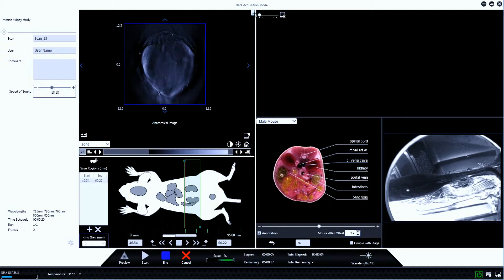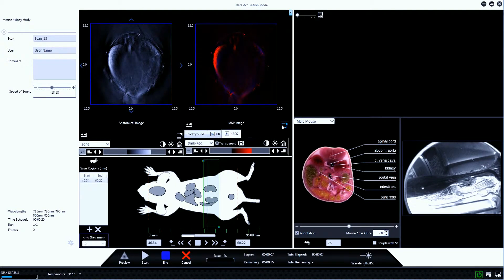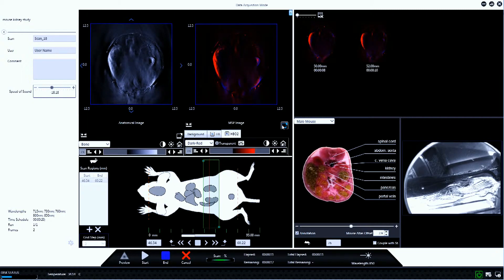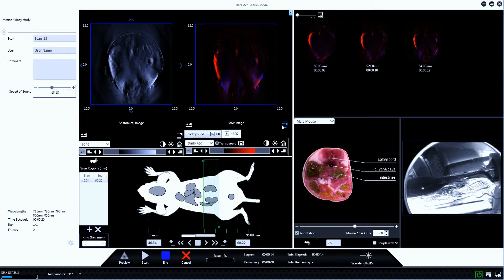During the acquisition, single-wavelength images are displayed in real-time. In the case of multi-wavelength acquisition mode, spectrally distinct image components can also be displayed in real-time.